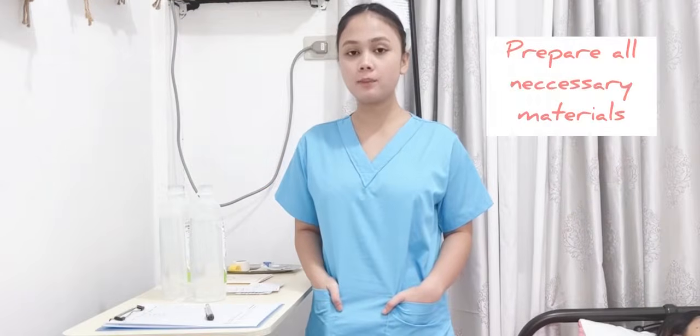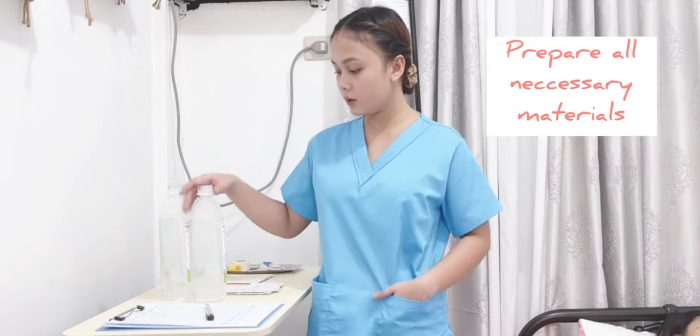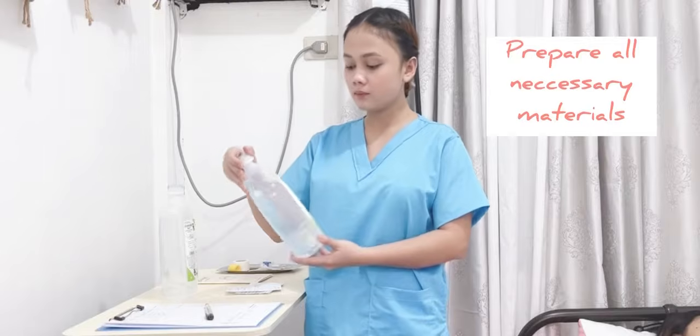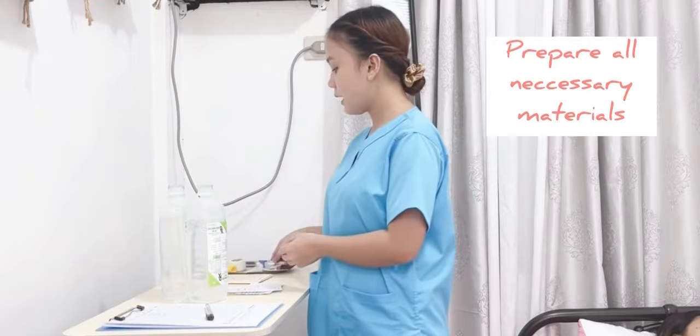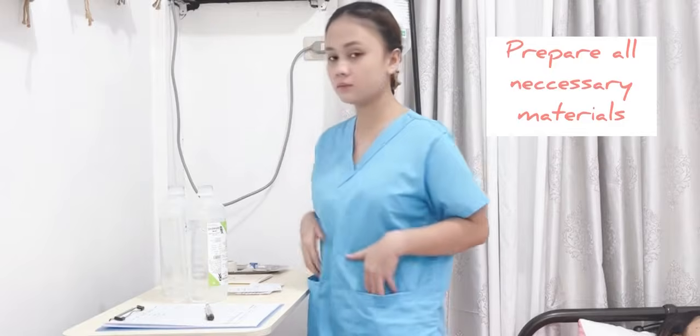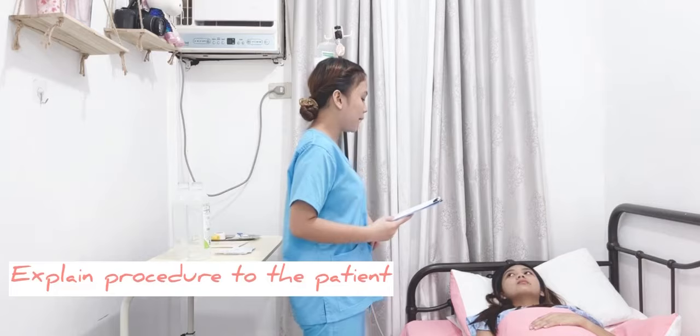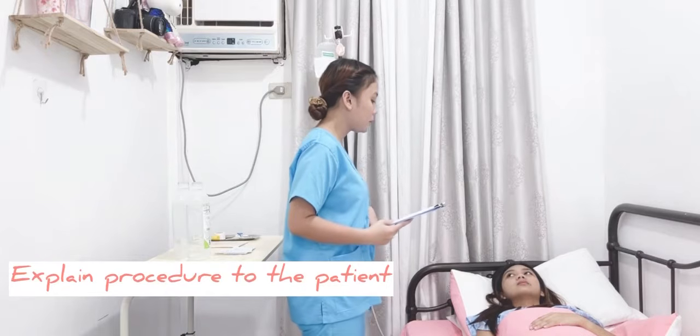Before I proceed to the procedure, I will be preparing all the materials needed. I have here the correct IV solution together with the alcohol swab. Then wash hands to reduce transmission of microorganisms. Then explain the procedure to the client as it decreases anxiety and promotes cooperation.